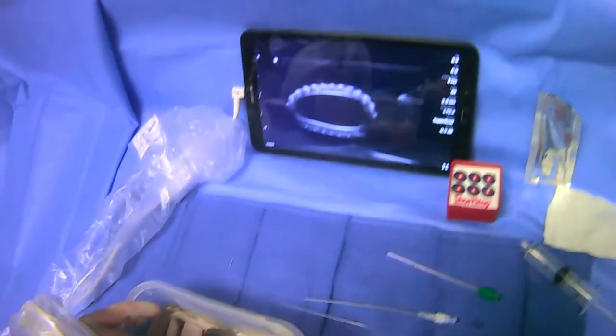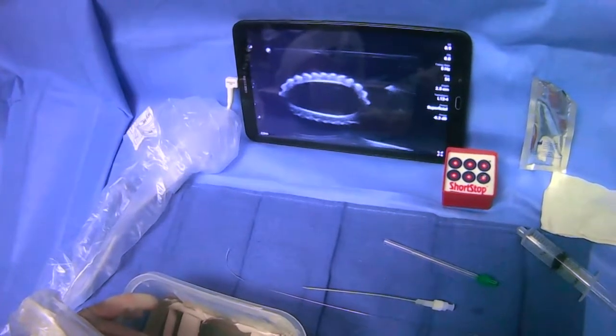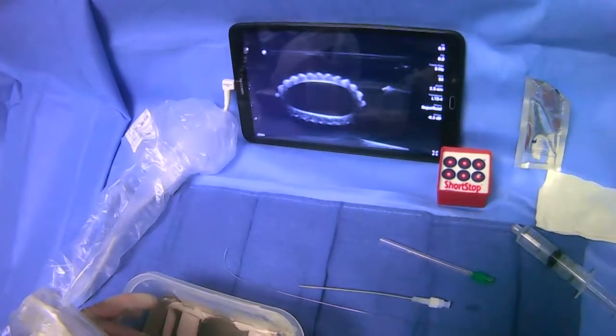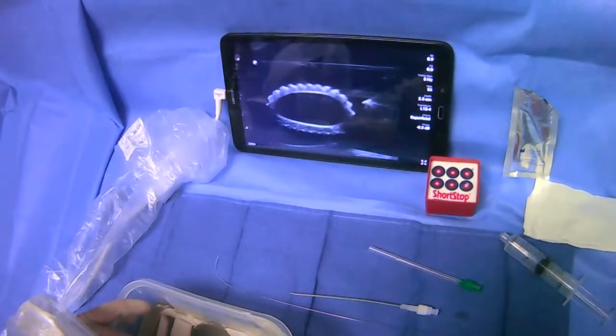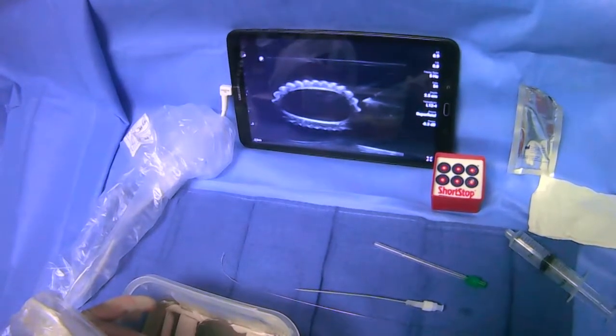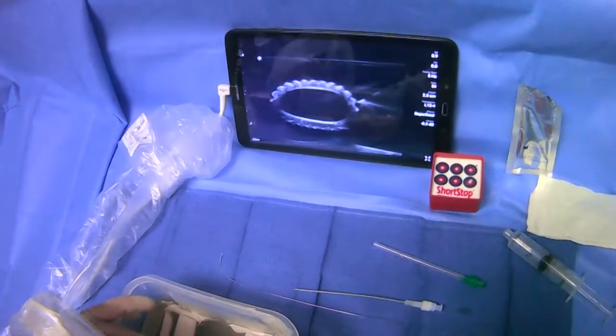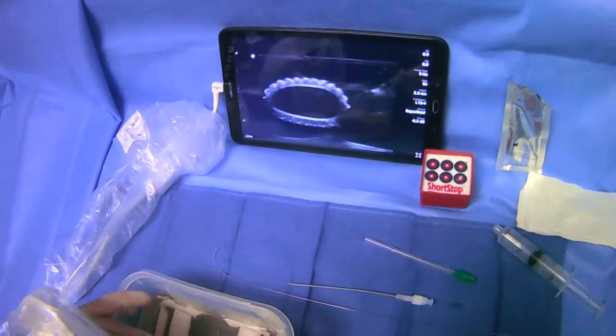As we advance, we'll look on the screen and we can see the needle tip there very clearly. We'll be giving our lidocaine as we advance forward, and we can adjust so we see the whole length of the needle. We give our lidocaine right outside the vessel where we're going to puncture, and then keep giving it on the way out.